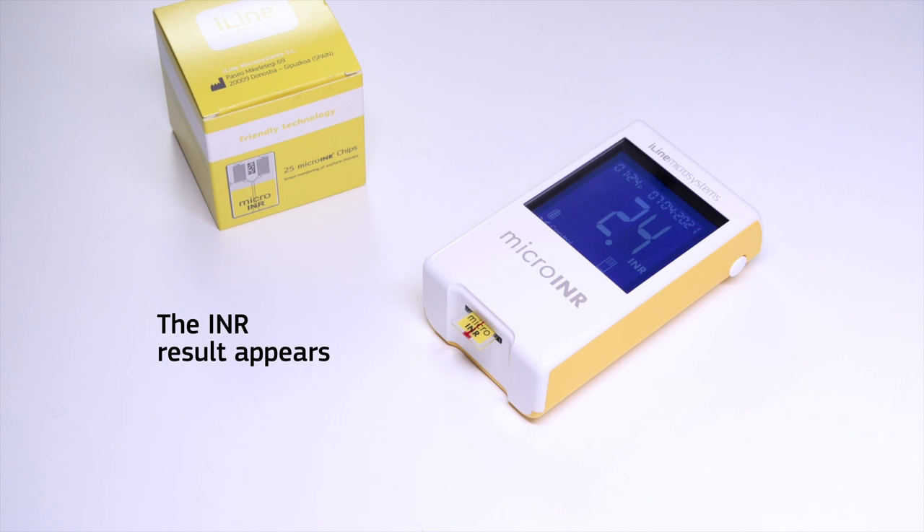Wait until the INR result appears. After obtaining the INR result, record it and follow the instructions given by your physician and/or your healthcare provider. The results are automatically stored in the meter's memory.